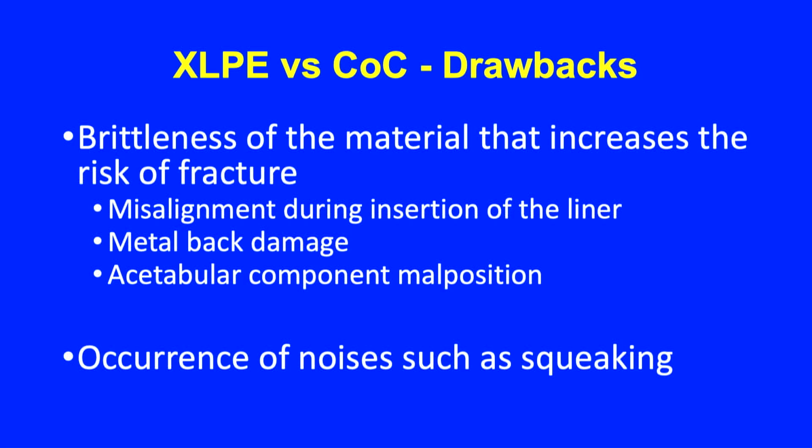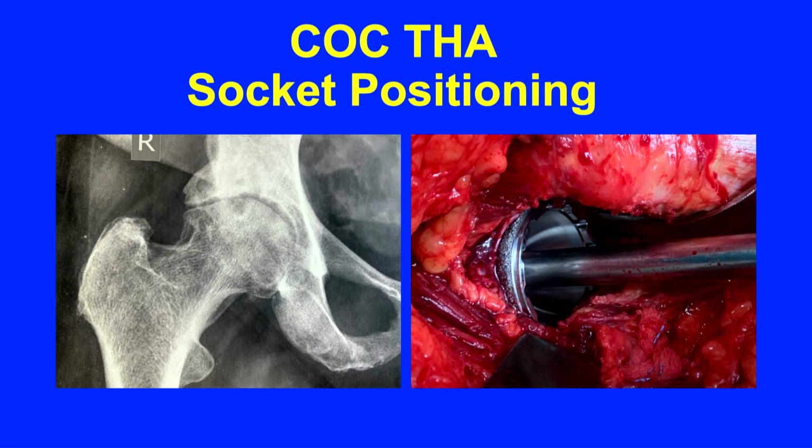There are definitely some drawbacks. It was talked about that in ceramics there is a lot of risk of fractures, which was not due to the material, but because of the technique, with which you perform these: edge loading and misalignment, metal back damage, or acetabular component malposition. Squeaking is a phenomenon, a problem, but it doesn't lead to any revision in general, and it has also been brought down. It was mainly pronounced in one of the company's products in the past.